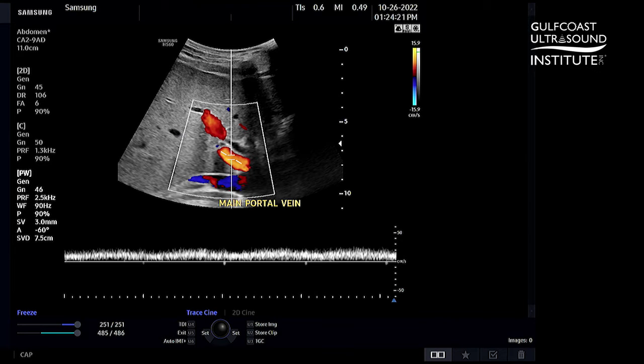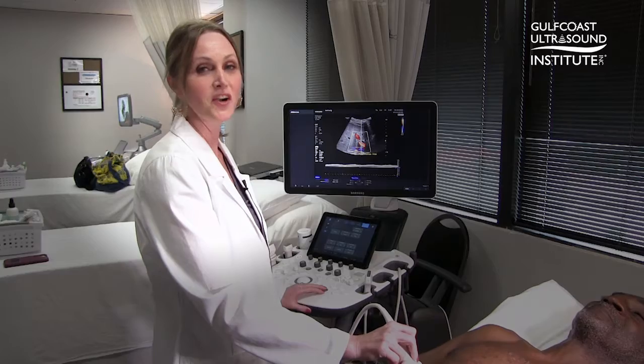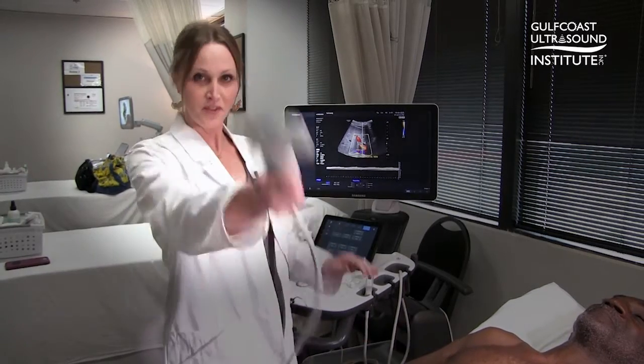Be sure to change your angle correction so that it's parallel with the vessel walls. This will also ensure when measuring velocities that your velocity is accurate. That's your hot tip of the day — now you give it a try.